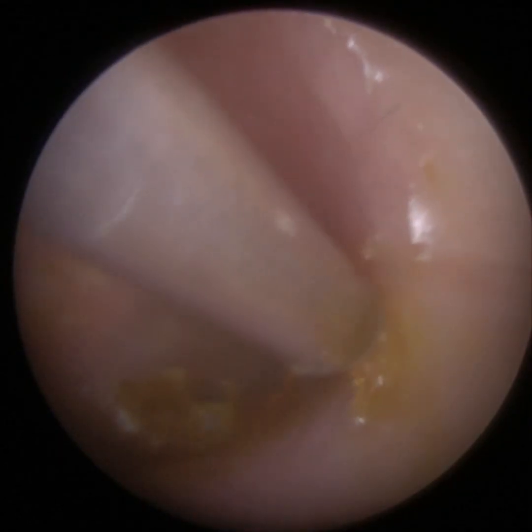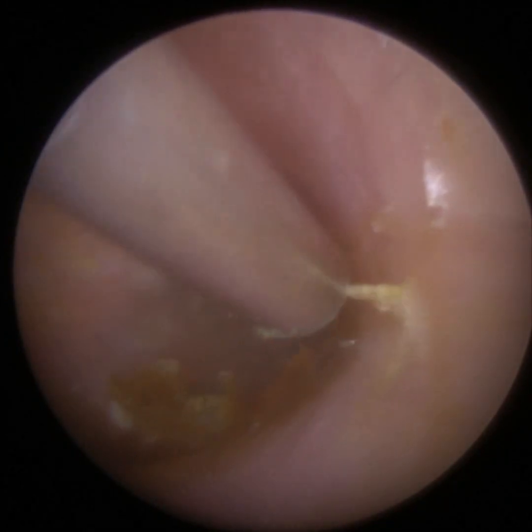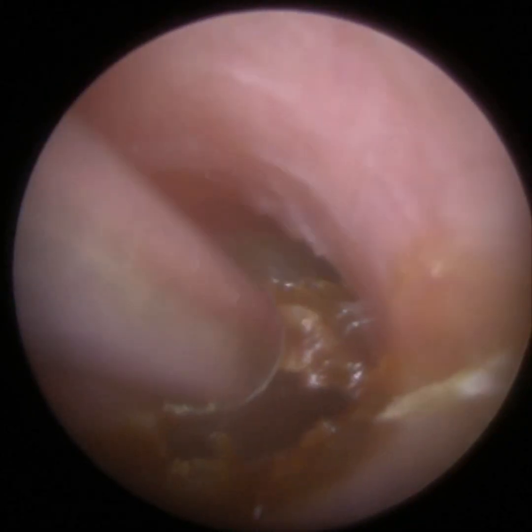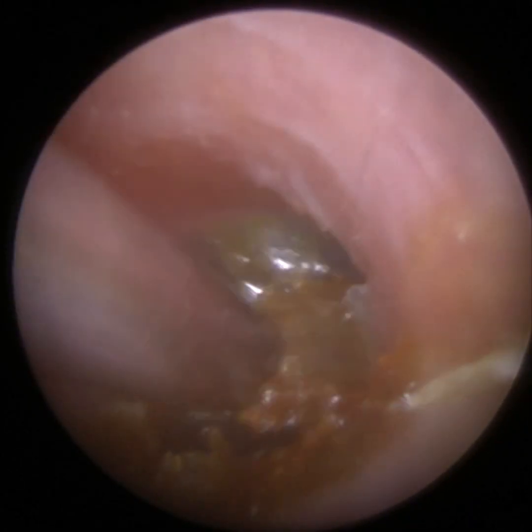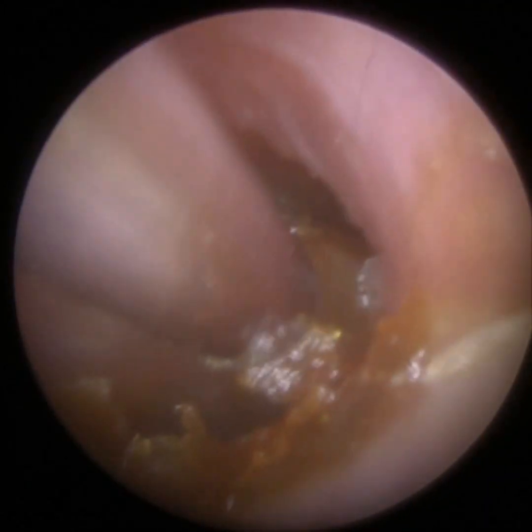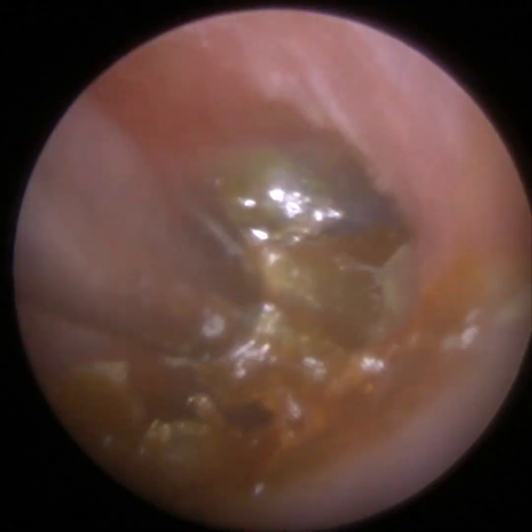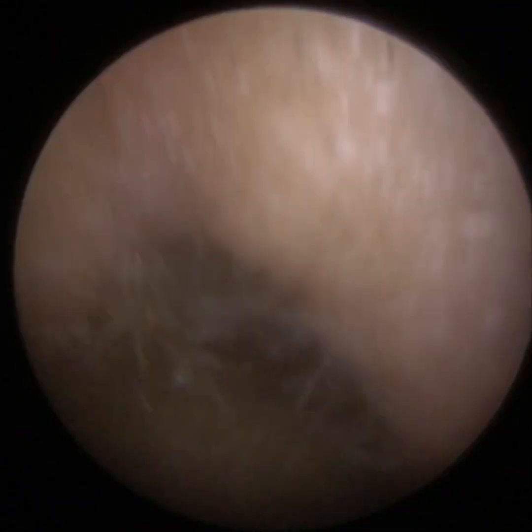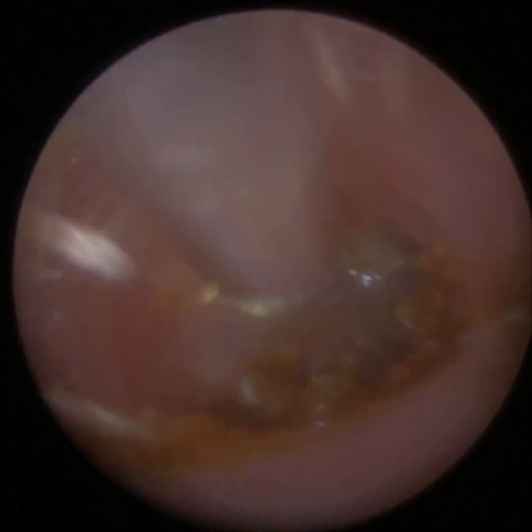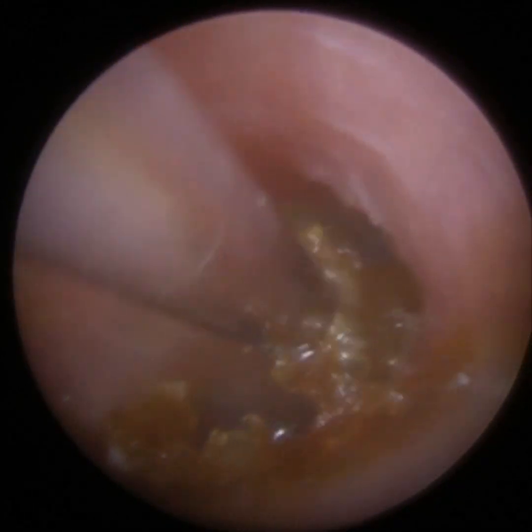Again, the patient's a bit unsteady at times, so we have to be really careful because we're right on the cusp of the ear canal, the bony part, and if we make contact with that, it's going to be really uncomfortable for the patient. So not only am I trying to avoid the canal wall, even if the patient was dead still, I'm also accommodating for these head movements at the same time, which can be really, really tricky. So you're almost looking at how the patient's head is moving, and you're accommodating for that movement whilst also trying to peel dead skin off the canal wall without making contact with the canal wall. So it can be really difficult, guys. But we managed in the end.